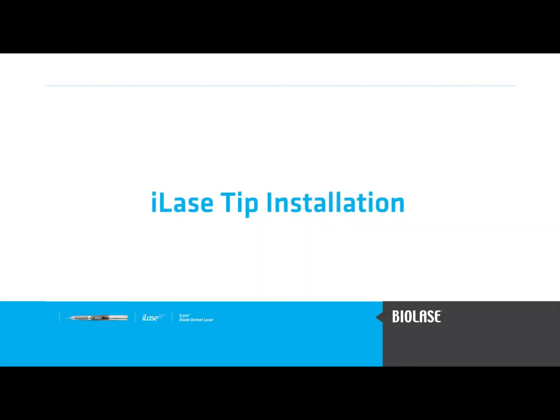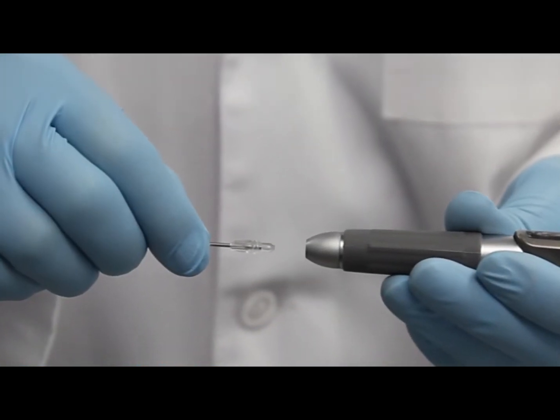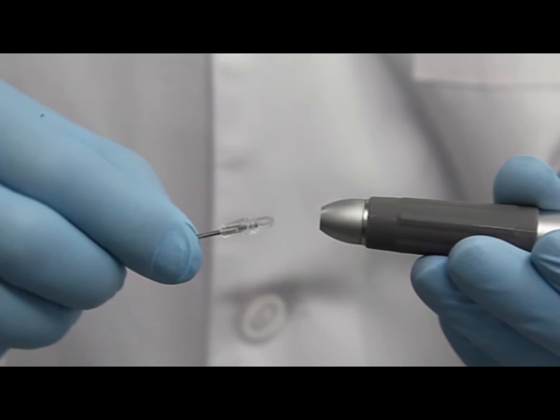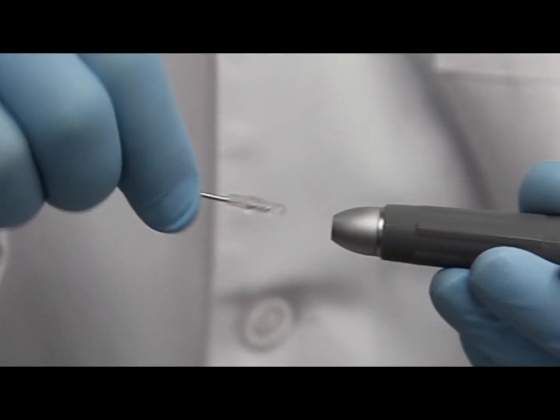Assure that your Biolase diode laser operates efficiently by correctly installing the laser tip. First, it is important to align the tip and handpiece in a straight line, not at an angle.